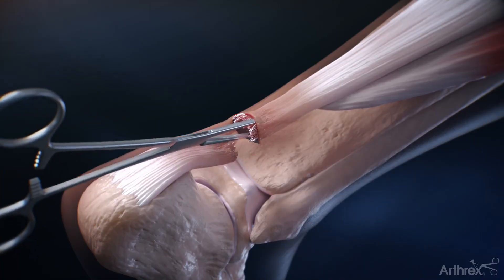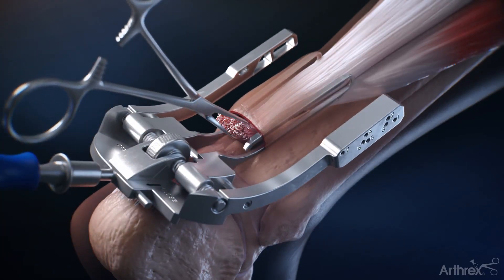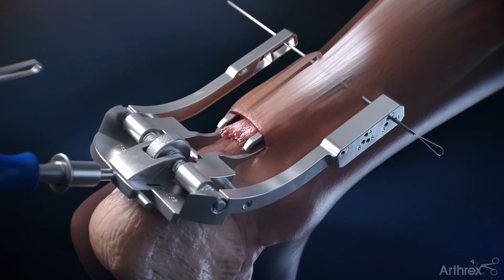The tendon is grasped and the jig is inserted with the inner arms inside the peritenon of the Achilles tendon. The first PARS needle is placed in the number one hole in the jig to stabilize the construct, while passing the other needles and sutures in sequential order.